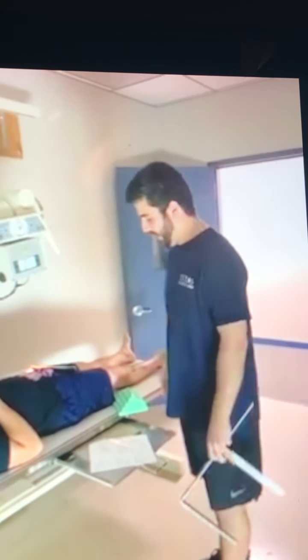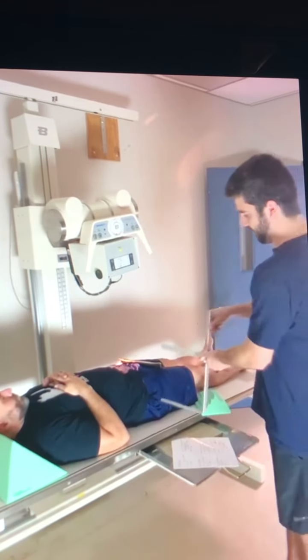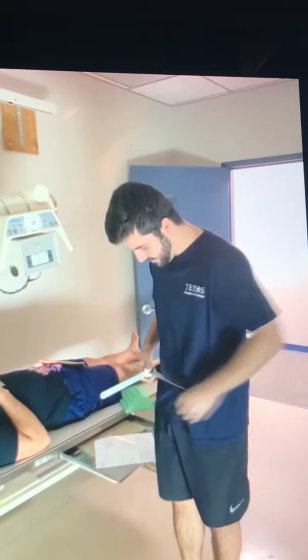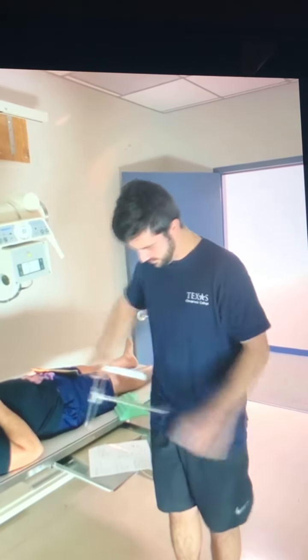So this is going to be AP coccyx. Perform AP coccyx. Again, he's laying on the table. So I'm going to be measuring myself because he is laying. So where it would be on the pubic symphysis, measure. But on the patient, not me.